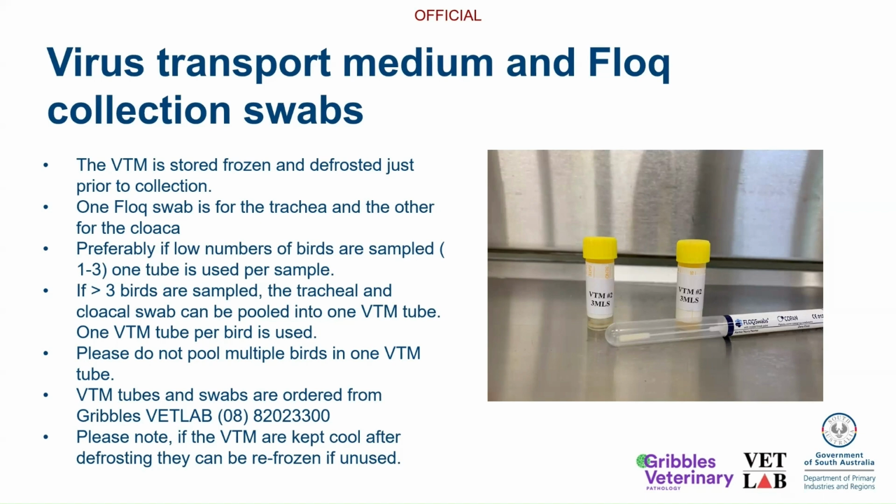And just a very, very small note, the virus transport media, even after it's defrosted, can actually be refrozen if the lid hasn't been taken off. That is, if it's an unused sample. So just a small point.